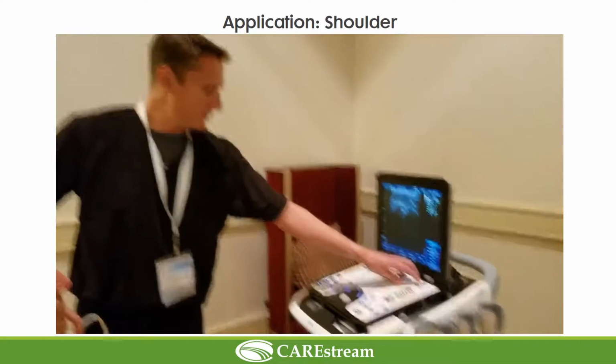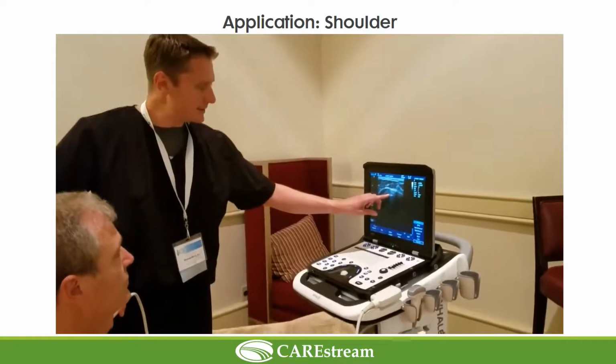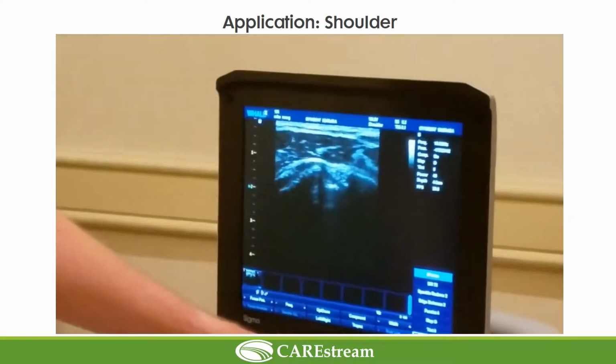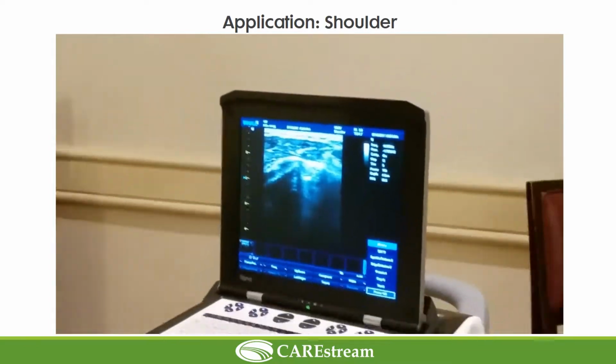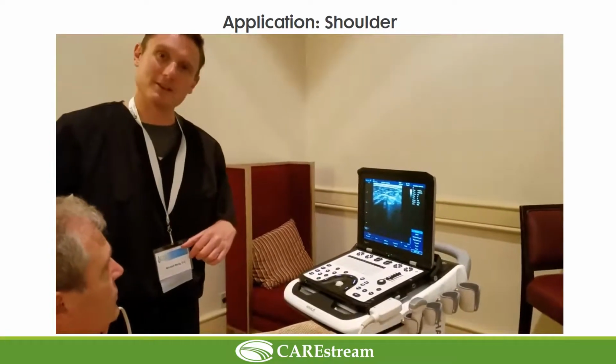One thing you may notice that's happening is now we increase our contrast. Now we can actually see fluid in the biceps tendon, whereas at the preset of 100, it was very difficult to appreciate that fluid there. So what's happening is we didn't have enough difference between the whites and the blacks to make a noticeable change.